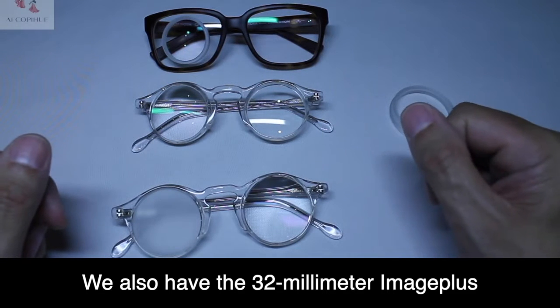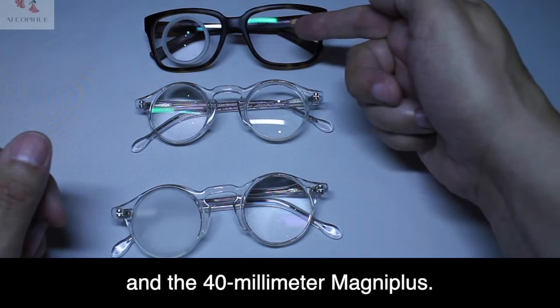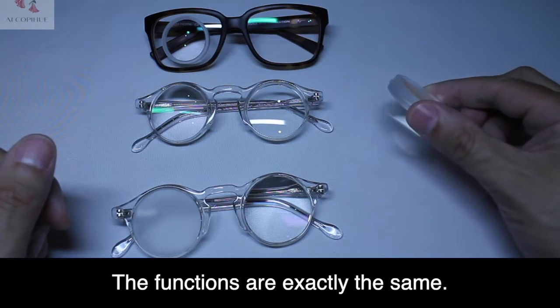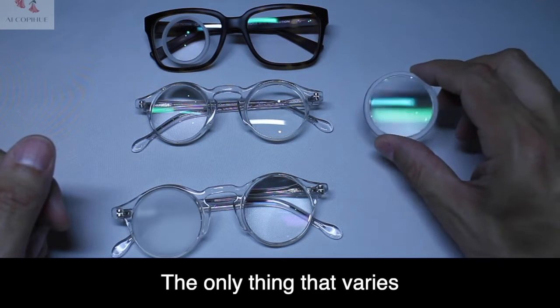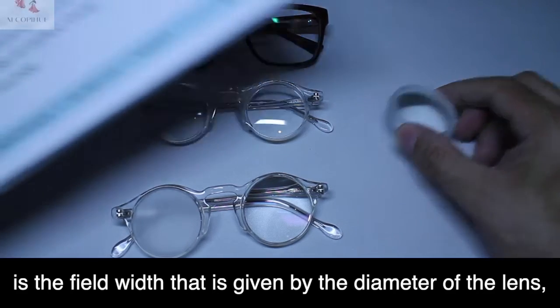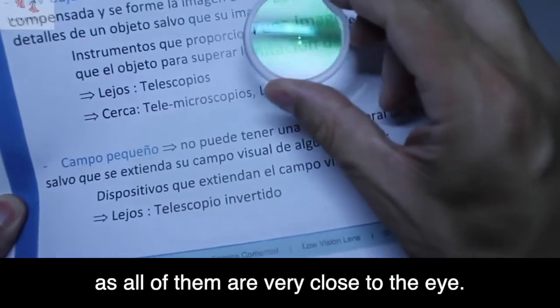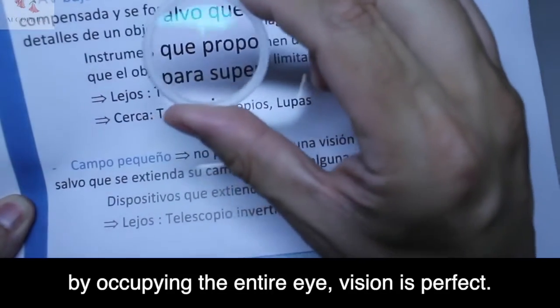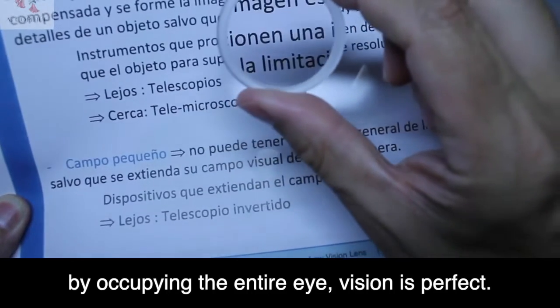We also have the 32mm ImagePlus and 40mm MagniPlus. The functions are exactly the same. The only difference is the field width, which is determined by the lens diameter. As all of them are very close to the eye and occupy the entire eye, vision is perfect.